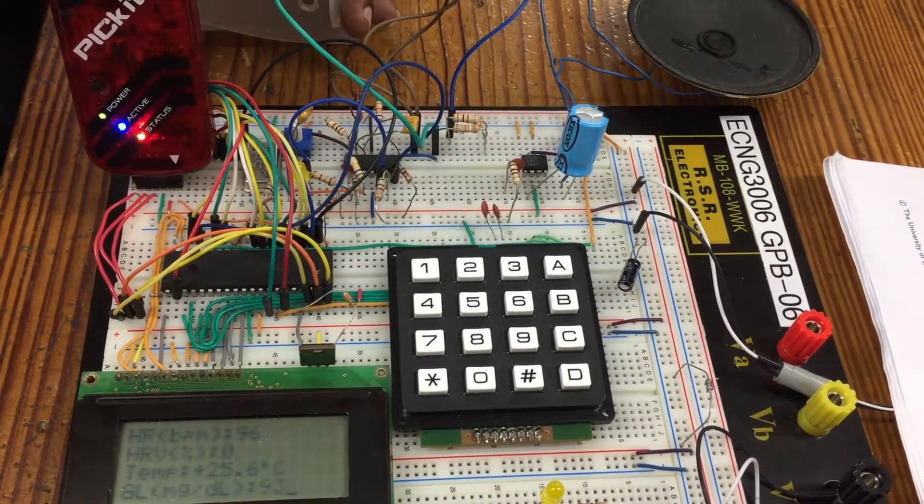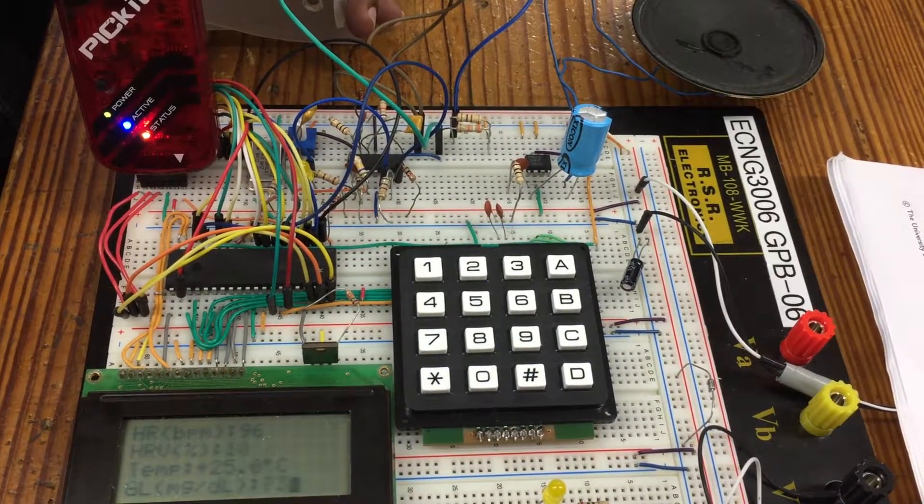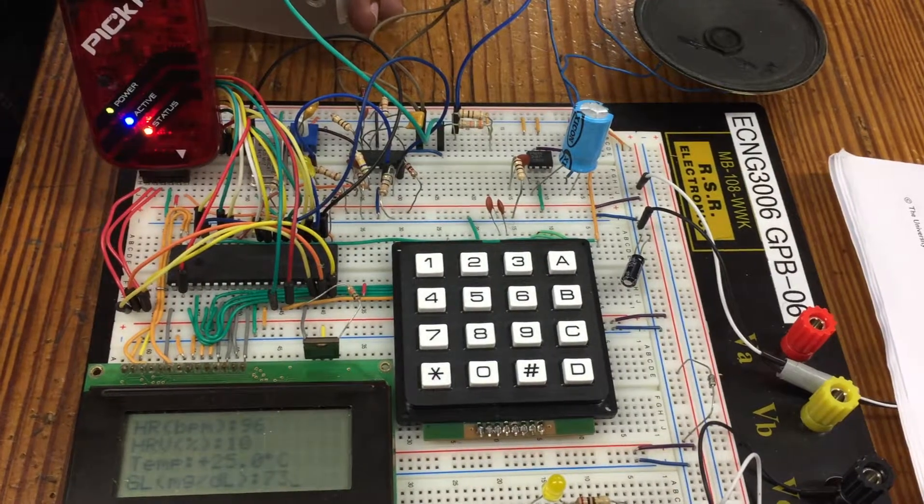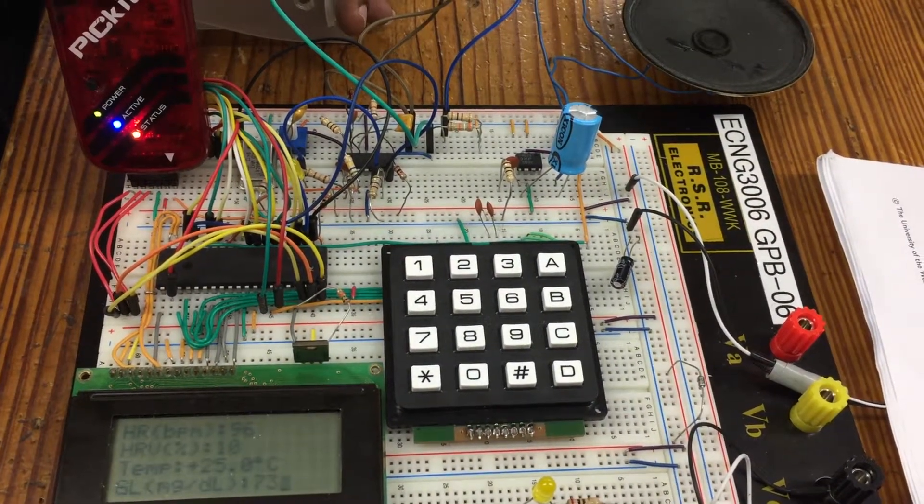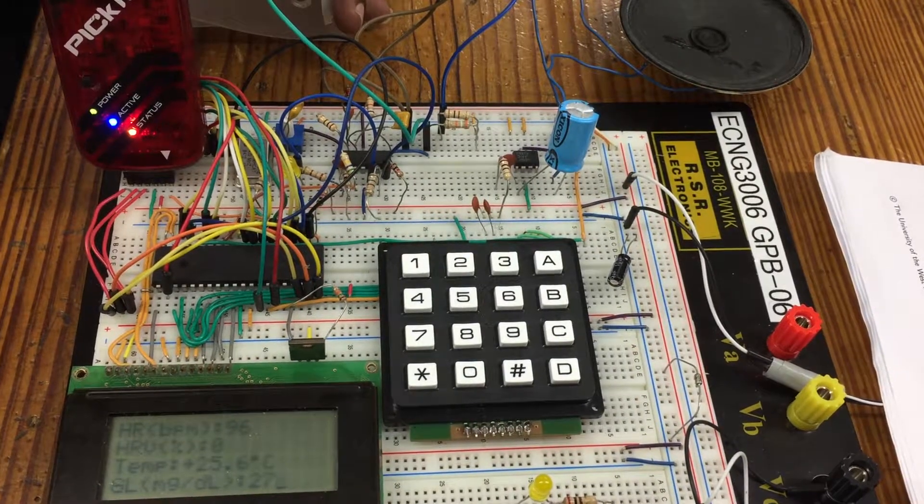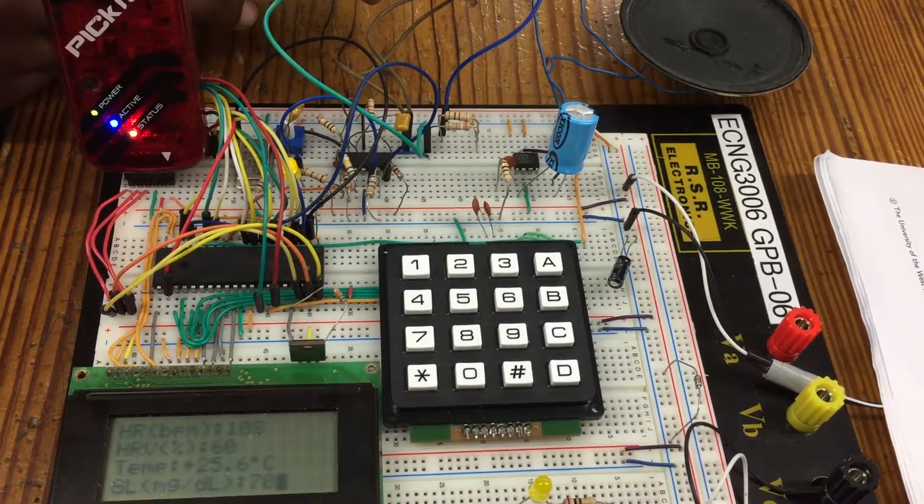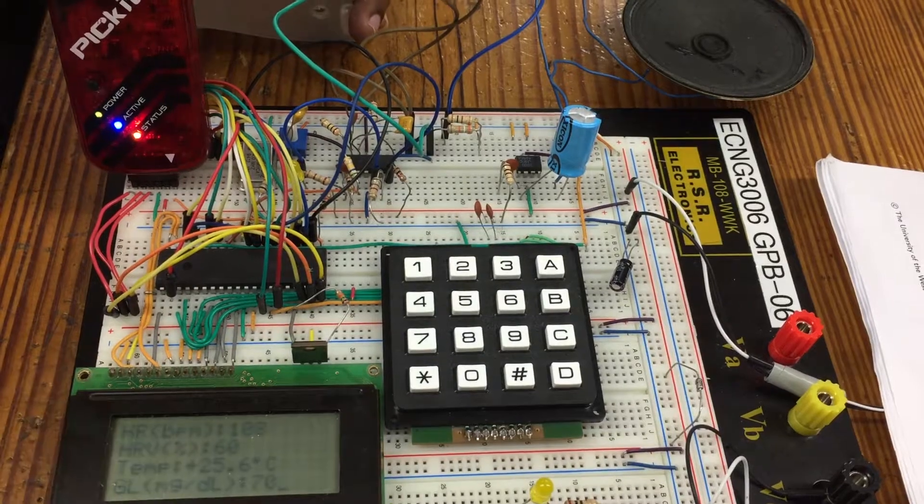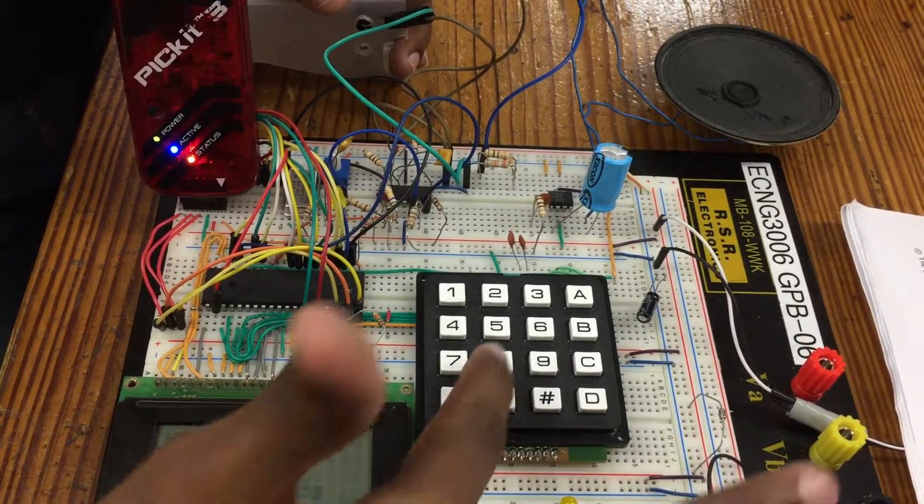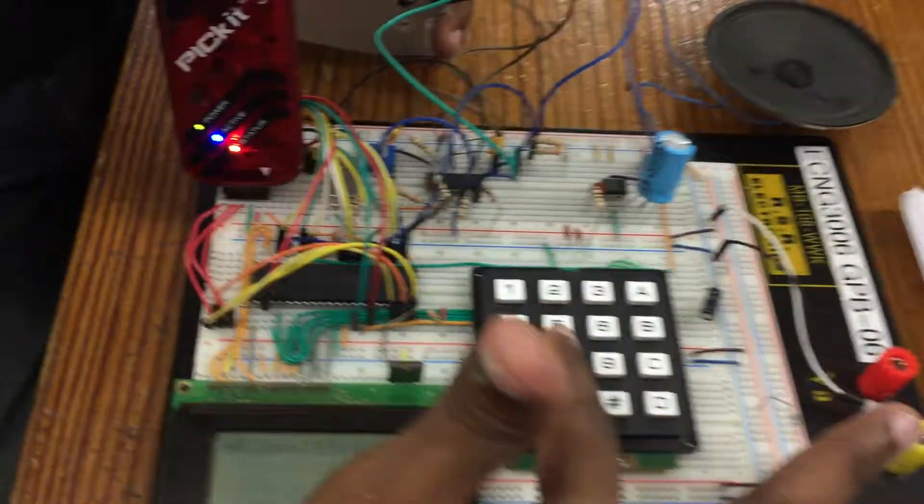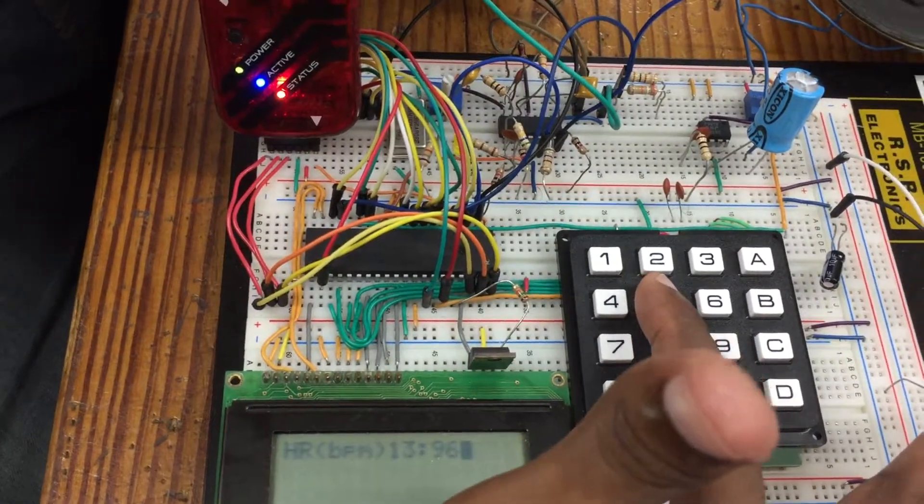So we have 96 now. 96 again. 96. If I move my finger, I can see that it's constantly taking accurate values. So if I scroll back to the memory now, you should see some values being skipped.